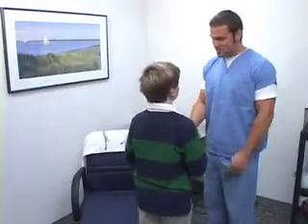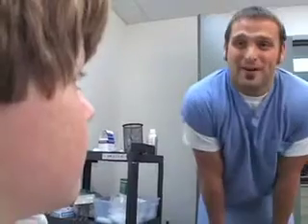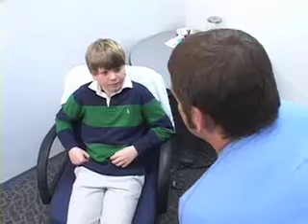This enables your physician to capture 24 to 72 hours of clinical data without a hospital admission, thus resulting in greater convenience and less cost. When you arrive at our DigiTrace Service Center, you will be greeted by one of our EEG technologists who has been trained, licensed, and credentialed to perform this type of test.